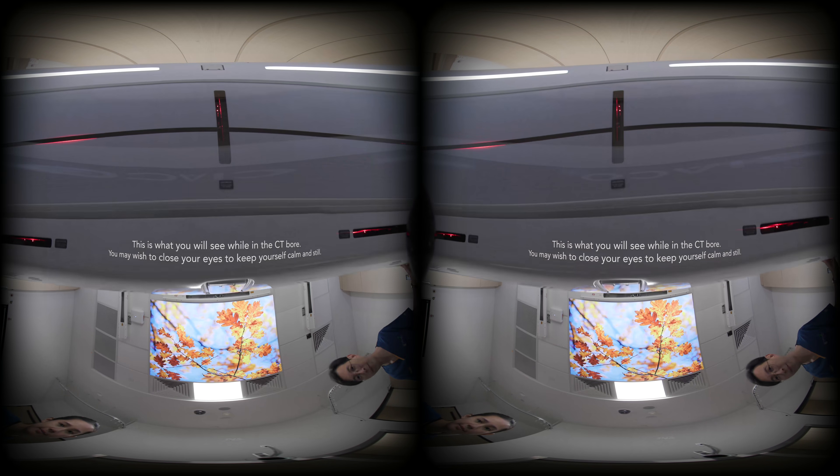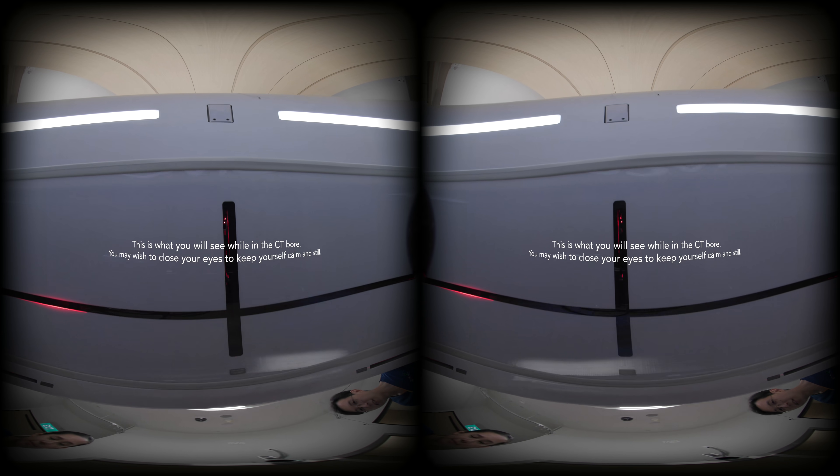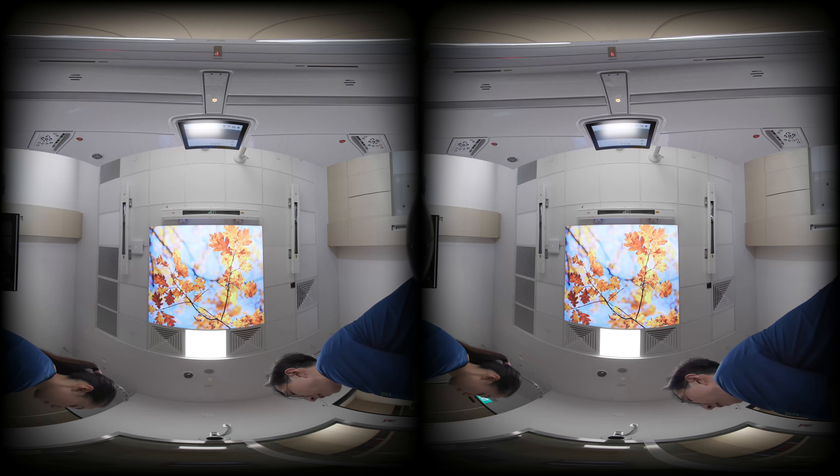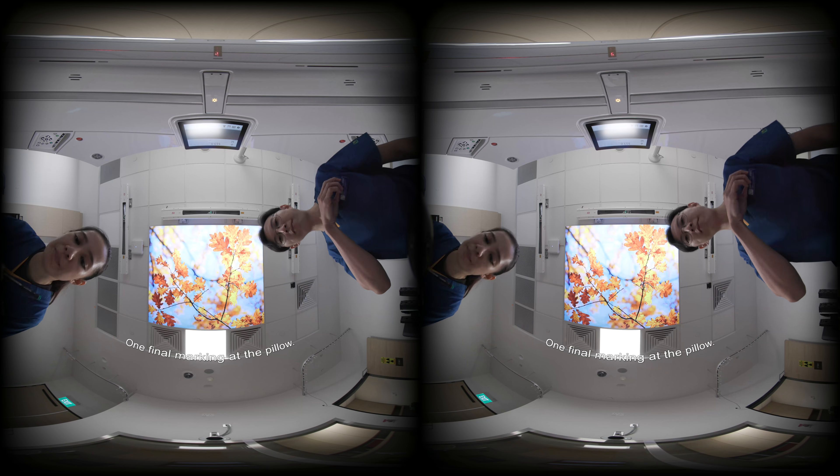Close your eyes. We're all done with the scan and we'll be removing the mask now. Don't move your head. Doing very well. One final marking at the pillow.